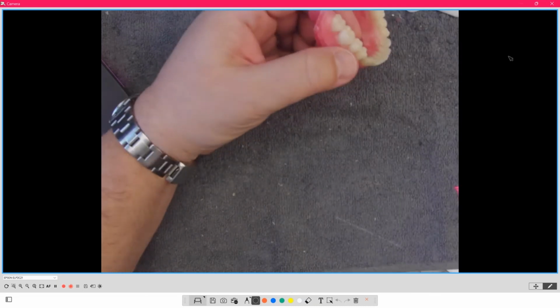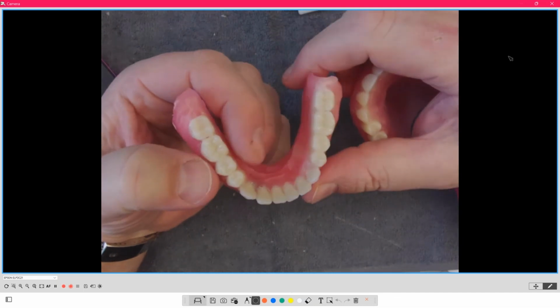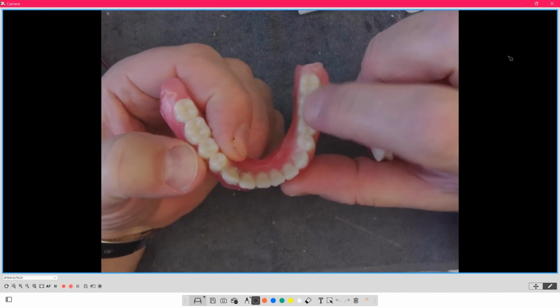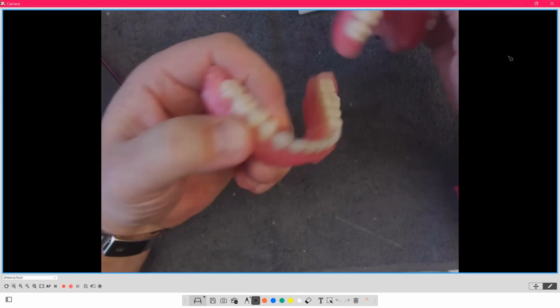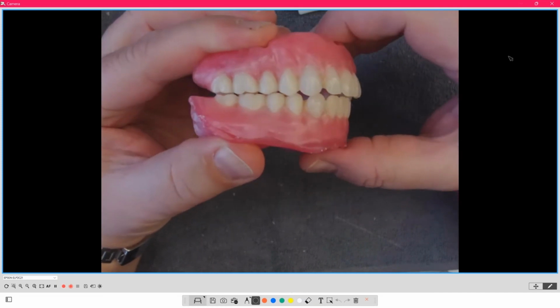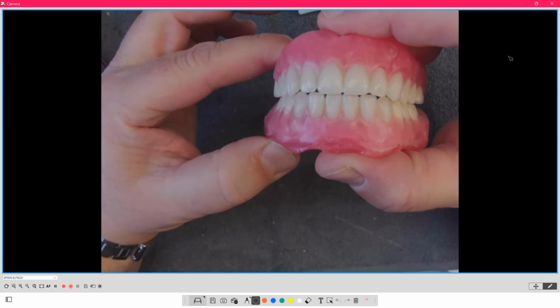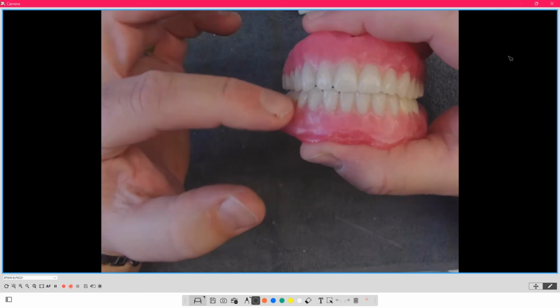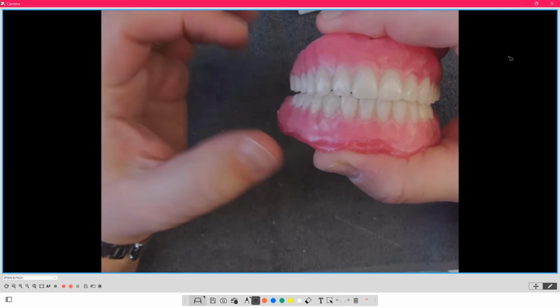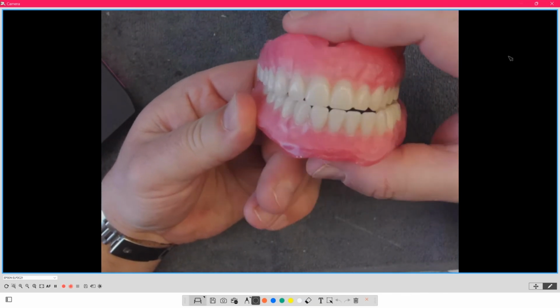So this is Lingoform. So this is VITA. So this is the mortar and pestle. This is what's, again, eliminated the lettuce issue. You can see now it's not locked in. It's a little bit of difference, a little bit more open. But when we look at it from this, again, it doesn't look open. It hides itself. Okay, so you don't see lingualized occlusion per se. So it hides itself.